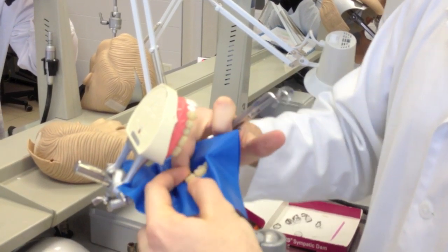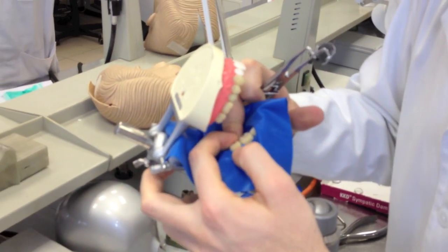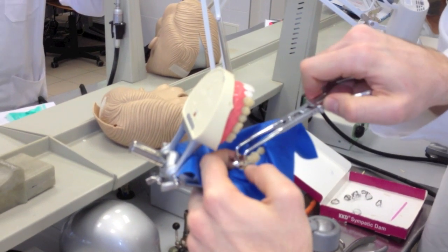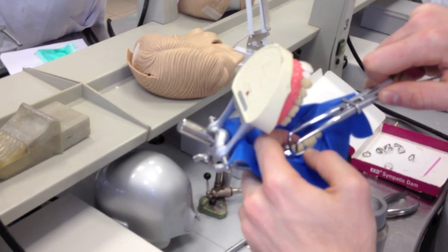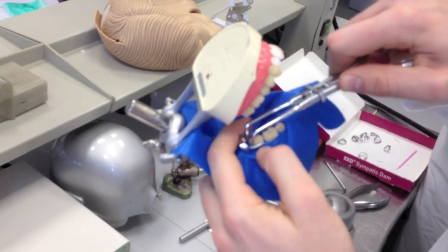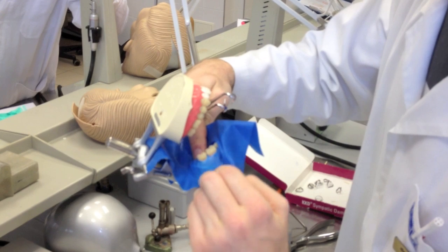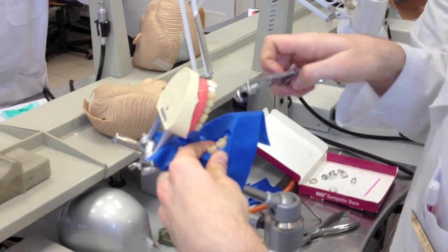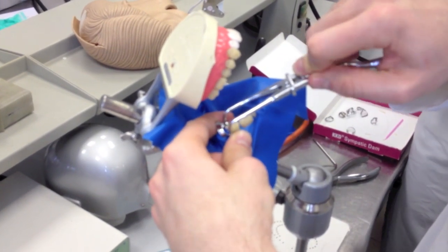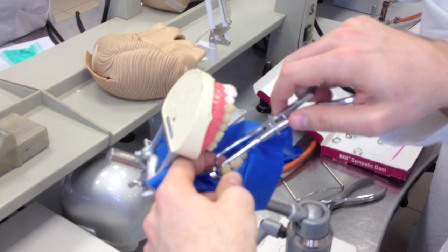Now I will place it on the seven. You and your assistant should keep the rubber away from the tooth. So when you place the clamp, you do not risk placing the rubber between the gum and the tooth. You always have to be sure that the rubber is between the clamp and the gum, because then it can isolate.